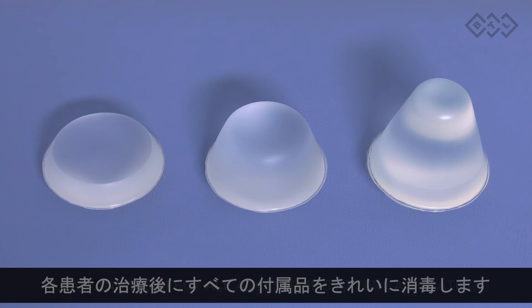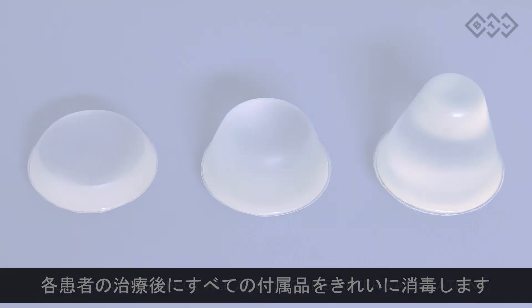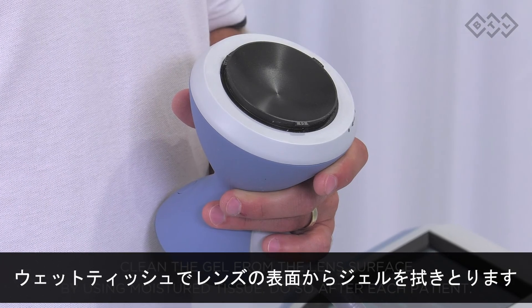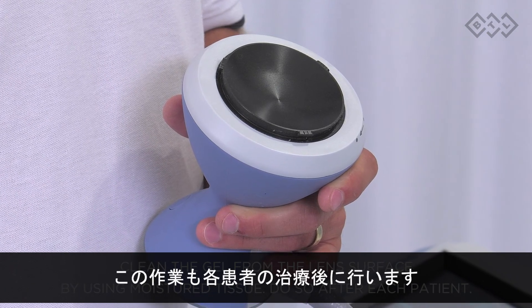Now it is time to learn about maintenance. Clean and disinfect all accessories after each patient. Clean the gel from the lens surface by using a moisturized tissue — do so after each patient.